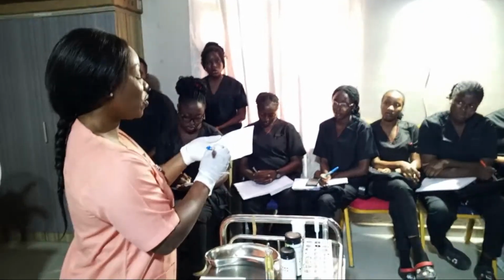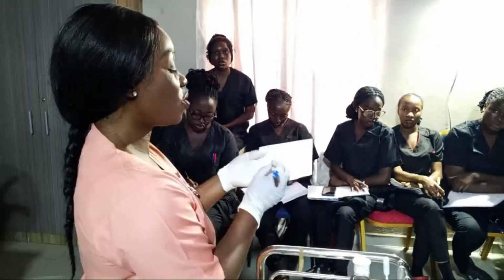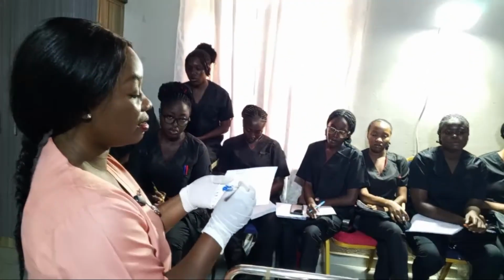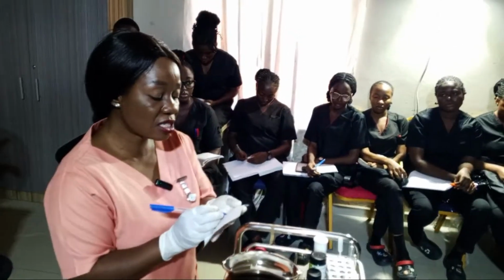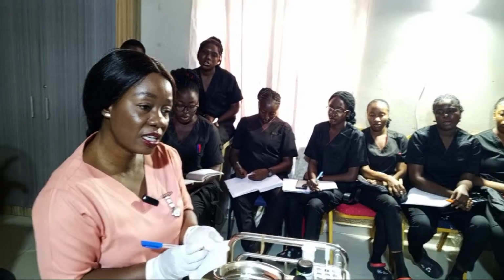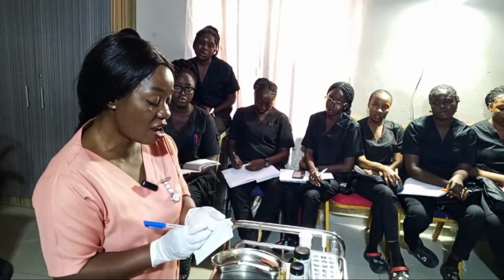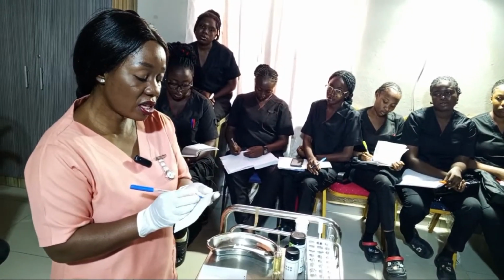So when you write this, then you write here glucose. Glucose what? Nil, right? Glucose nil. Specific gravity. We say specific gravity is 1.030. And we say the color is what? Okay.